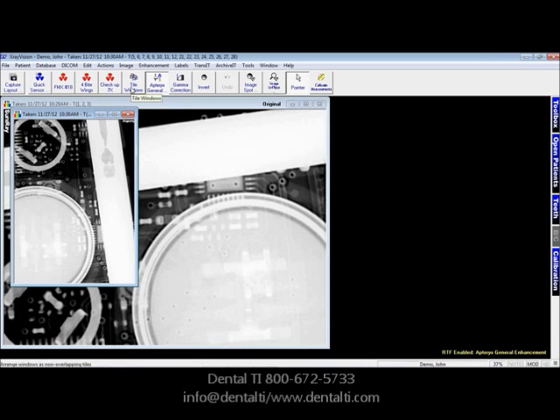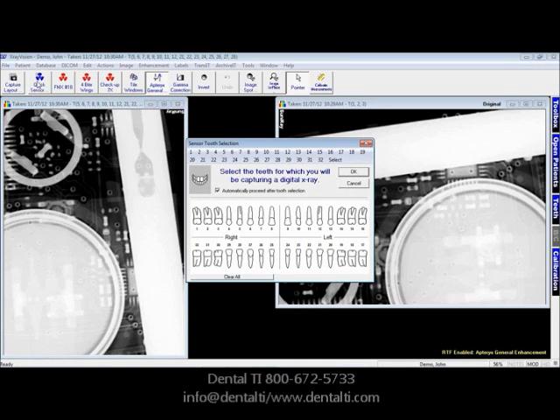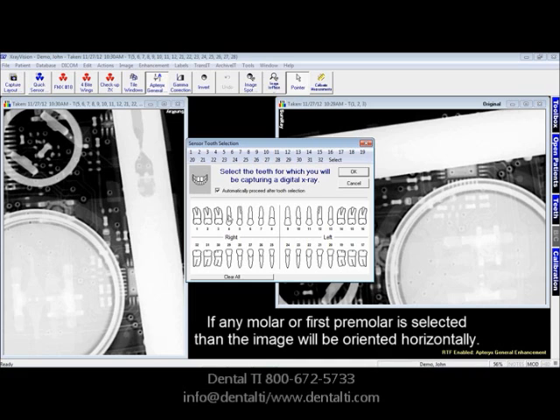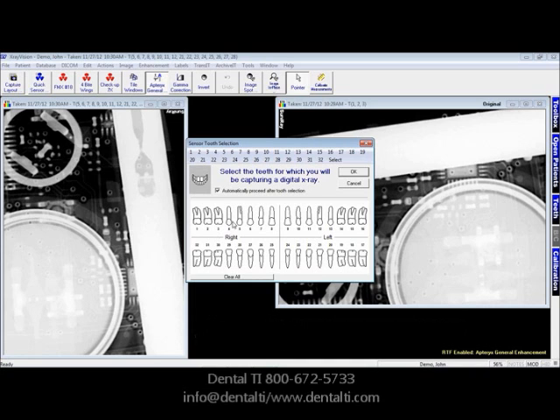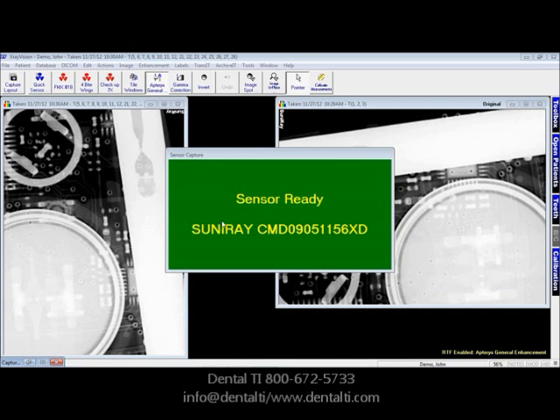We're going to tile the windows, which will put these images side by side. If you're wanting an image to be horizontal, make sure that either a premolar or a molar is in the image. Selecting 5 by itself would produce a vertically oriented image, while selecting 4, 5, and 3 will produce a horizontally oriented image.